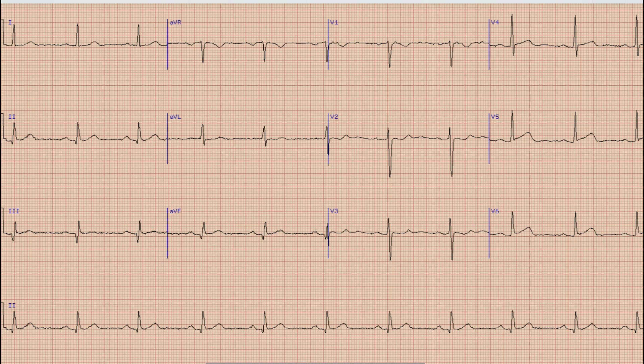As you know from our previous videos, the first thing that we look at on the ECG is rhythm. For rhythm we look at the rhythm strip, that is lead 2 at the bottom of the ECG. You can see there are upright and prominent P waves before each QRS complex, which means that the rhythm in this case is sinus rhythm.